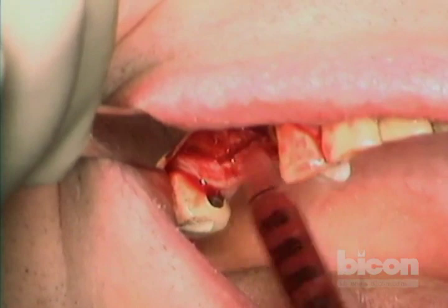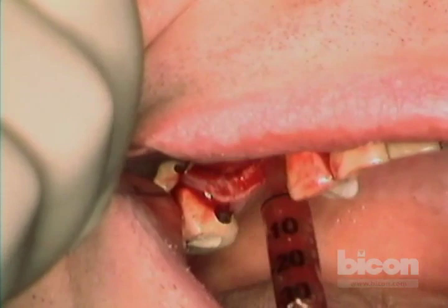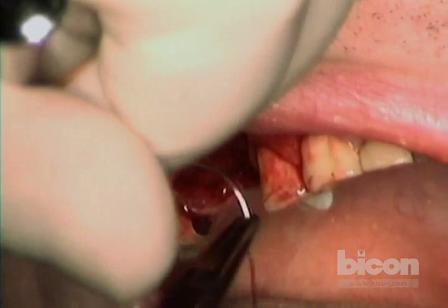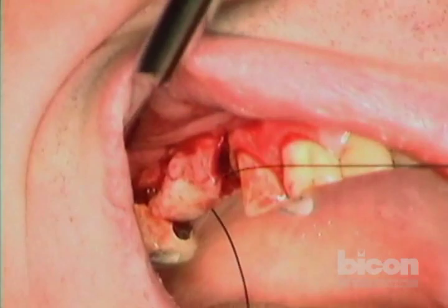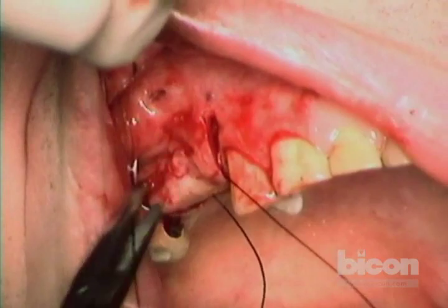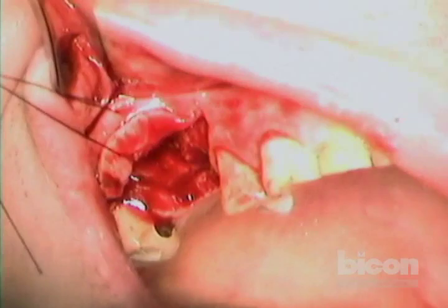We'll collect as much blood as possible and set it aside until we mix it with the Synthograft. When asked how to stop clotting, I don't — I let it clot and then break up the clot into the bone graft. I think this creates a favorable environment to stimulate more inflammatory response in the area, which enhances healing. Because we are filming and talking, we'll have a more congealed clot, so we will add some more blood at the end.